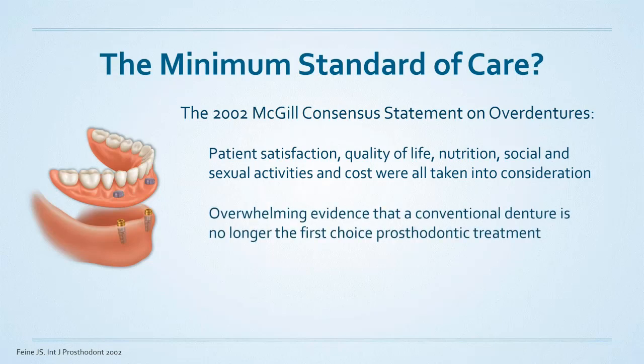Absolutely. The general idea of this consensus is that the 2 implant overdenture is a really wonderful first choice option for our patient. It is the overwhelming choice for our patients. And if I have a patient that's soon to be missing all their teeth, I'm at the point where I really just refuse to do the treatment if the patient doesn't want to do implants. And the reason is that they're never really going to be that happy.